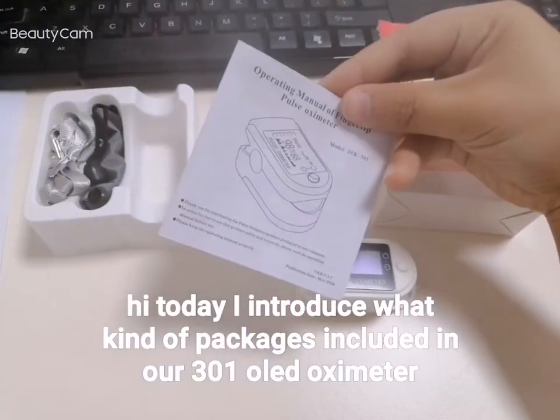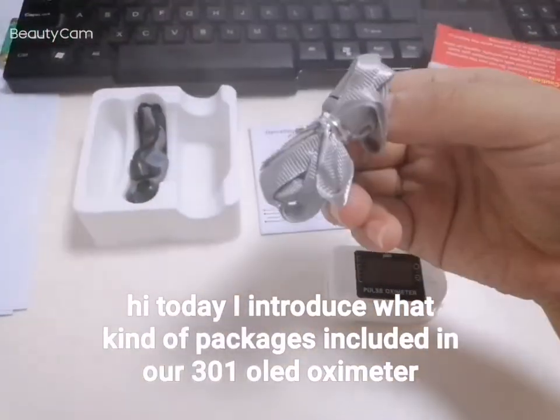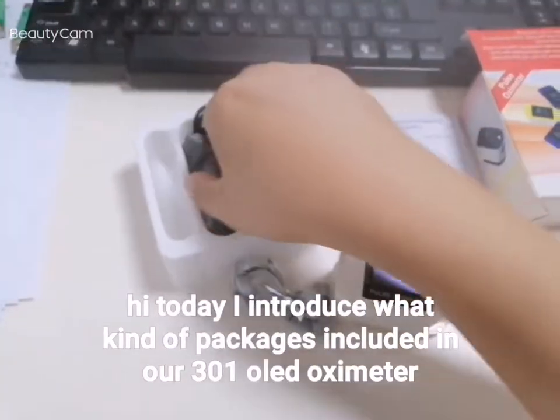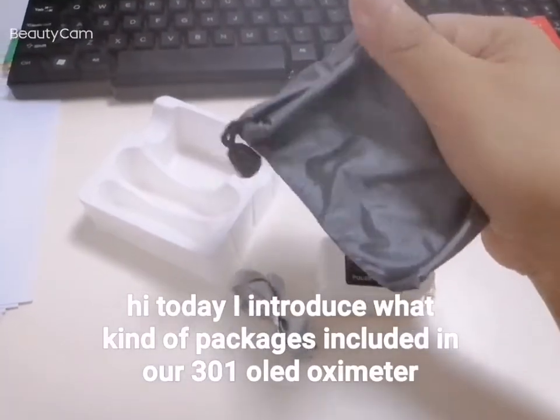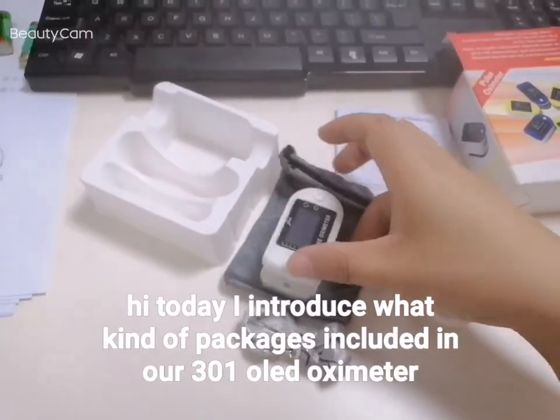Second, it is the user manual. Third, it is a strip. Fourth, it is a carry bag. You could put your pulse oximeter inside this bag.